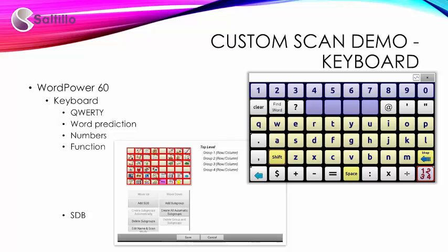Another example of a page where you might want to create a custom scan for one page that is different than all the others is a keyboard. A keyboard is set up in a separate layout than the rest of the vocabulary file, and therefore you would probably want a different scan pattern. I will use the WordPower 60 keyboard, continuing with one switch setup, block scan, and auditory prompts on. As I view the keyboard, I visualize the scan areas. I will break the keyboard page into four groups: the QWERTY letters, the numbers, word prediction, and function keys. I will also create an option order for the speech display bar.